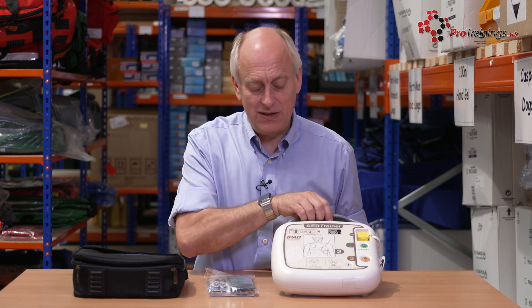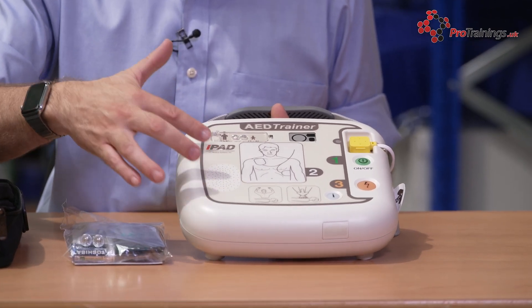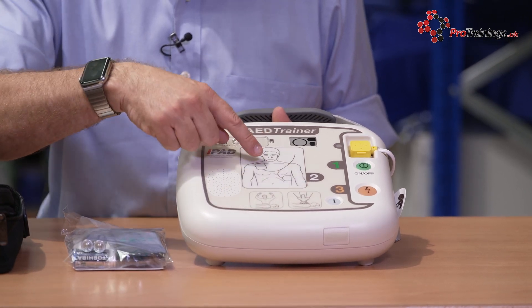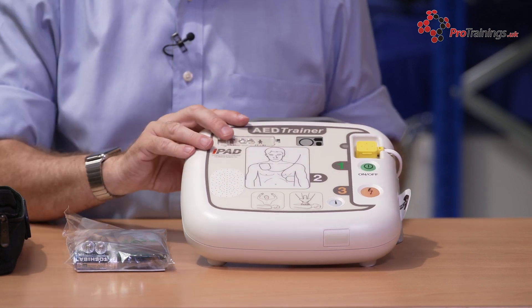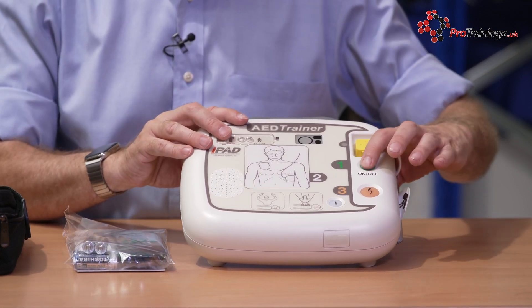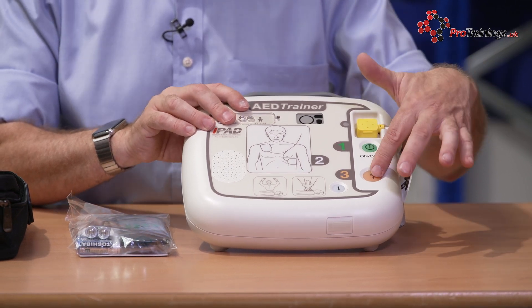Looking at the front of it, you've got a carry handle — same as with the live unit — and a speaker on the front. You can adjust the volume, and there are indicators on the front to show when the pads are on. It's a simple one, two, three instructions. To turn it on, all you need to do is hit the on button, and to turn it off, you push the same button and hold it a few seconds to switch off.